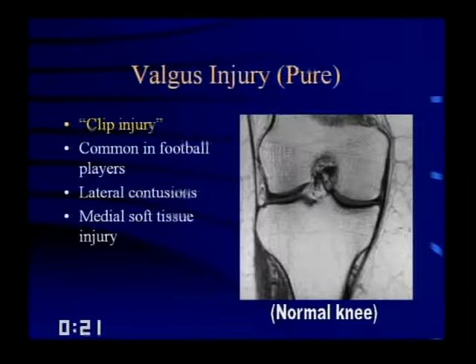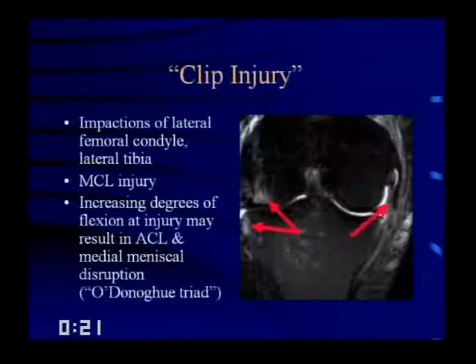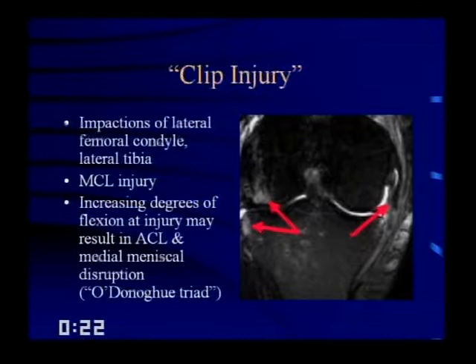Here's a clipping injury with impactions of the lateral femoral condyle and lateral tibia. The MCL stops abruptly — a full-thickness MCL tear. With increasing degrees of flexion at injury, this can result in ACL and medial meniscal disruption: the so-called O'Donoghue's triad, which is actually surprisingly rare. Grading MCL injuries: Grade 1 is a sprain — edema superficial to the MCL. Grade 2 is a partial tear with intrasubstance increased signal within the ligament. Grade 3 is complete disruption of the MCL.